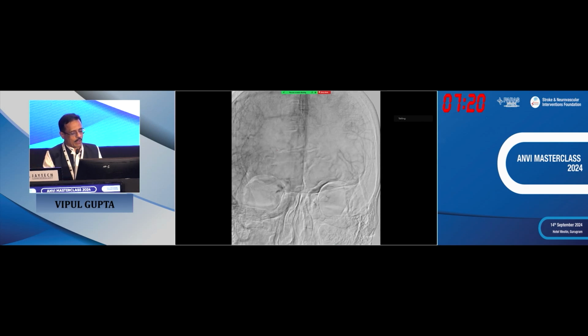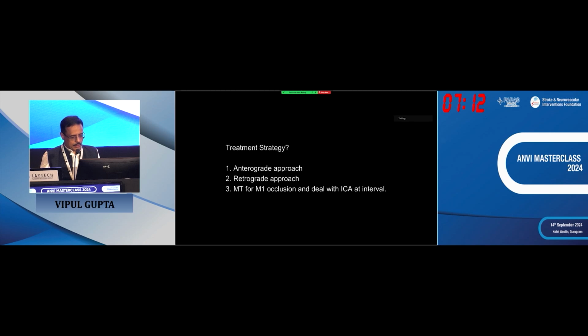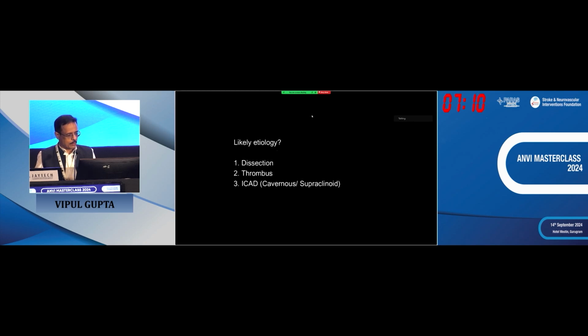We did check for collaterals in these cases. This was a poor patient. We knew stenting was going to be an issue. So we knew there was a great ACOM. So the first was, okay, all right, stop it.